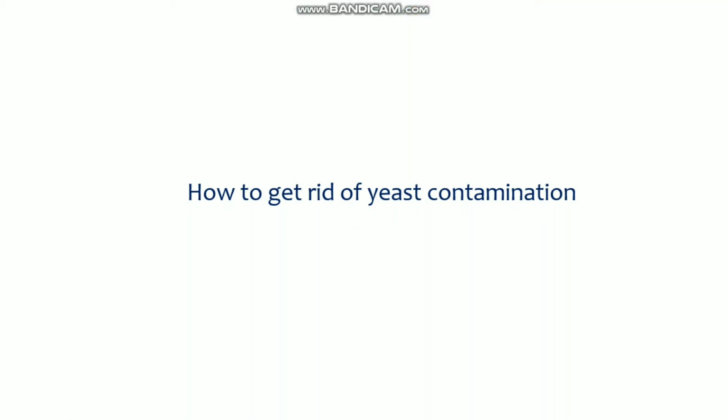In this tutorial video, I'm going to talk about how to get rid of yeast contamination. Yeast contamination is pretty common in the cell culture process, and during cell culture processing this kind of contamination happens. So we need to know how to get rid of it. Let's get started.